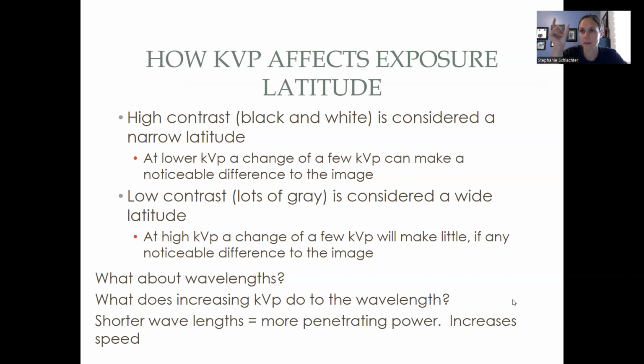Okay. So that's the same thing looking at another reason why changing KVP helps us. The higher KVP gets better penetration because those wavelengths get shorter and we know those penetrate more easily. Okay. They're faster, they're stronger, right? So they're getting through our patient more easily.